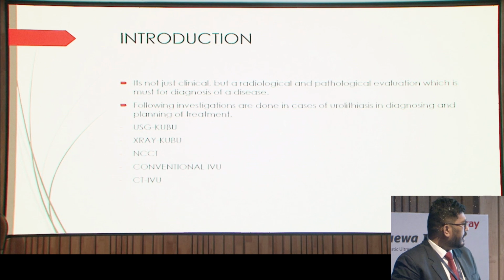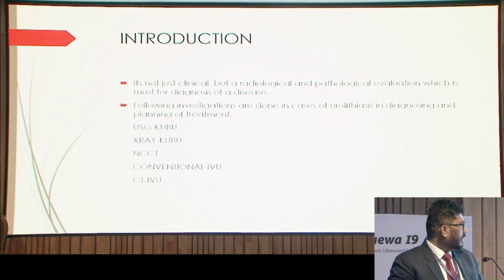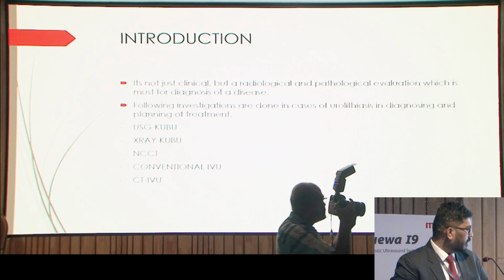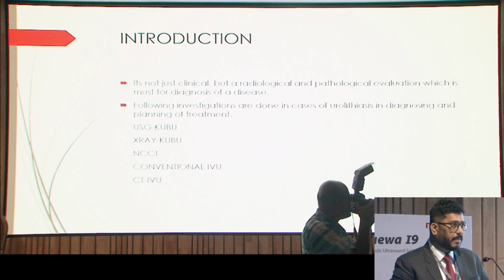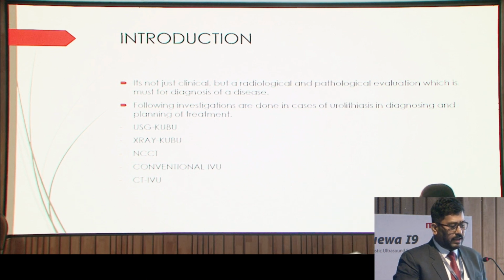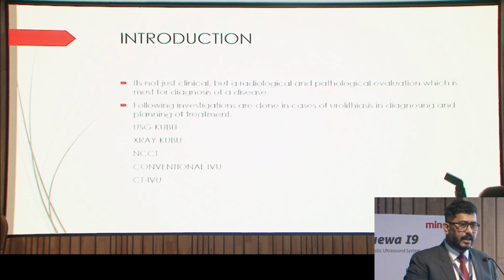From a urologist's perspective, I would like to distill for urolithiasis. These are the following investigations we would like to do for detection and for the management of stone disease. That is, sonography, X-ray, NCCT, conventional IVU and CT IVU.